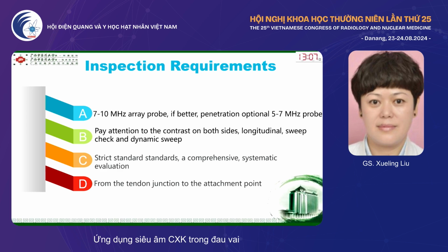Inspection requirements: A, a 7 to 10 megahertz probe. B, pay attention to the comparison of both sides, both static scan and dynamic scan. C, standard or comprehensive stretch. D, from the musculotendinous junction to the attachment point.